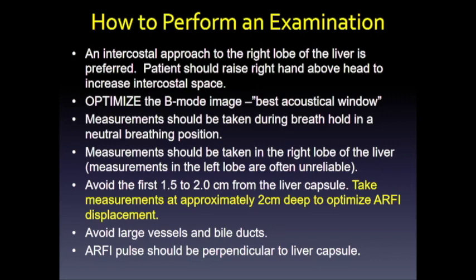Measurements should be taken during a breath hold in the neutral breathing position. We image the right lobe, typically segments 5, 7, or 8, seeking the best acoustical window. We avoid the first 1.5 to 2 centimeters from the liver capsule because refractive artifact there will give inaccurate measurements.